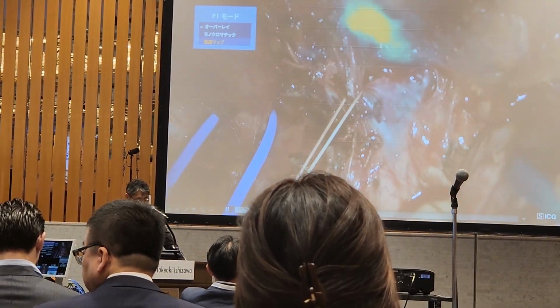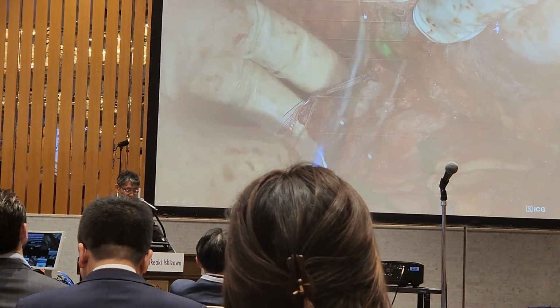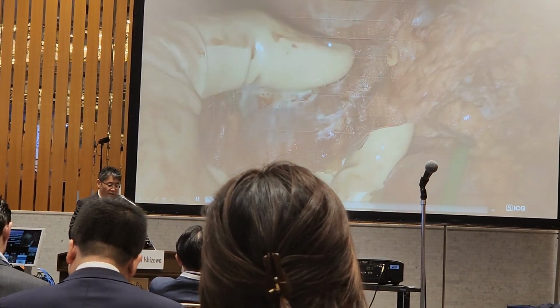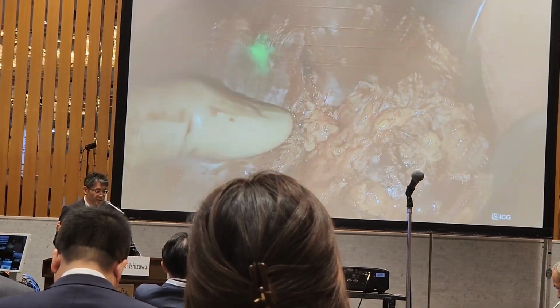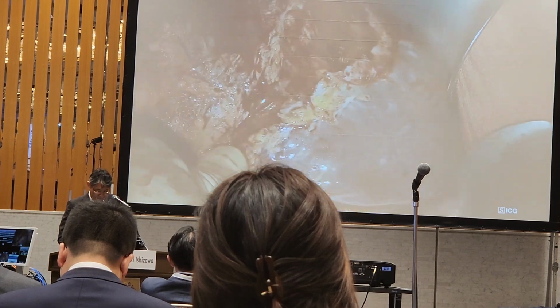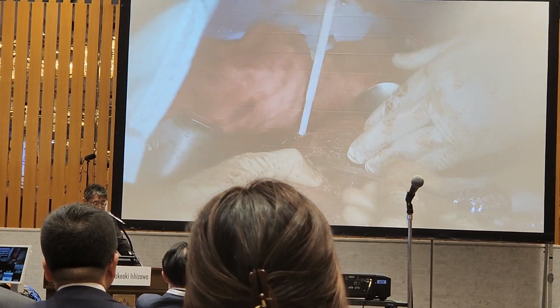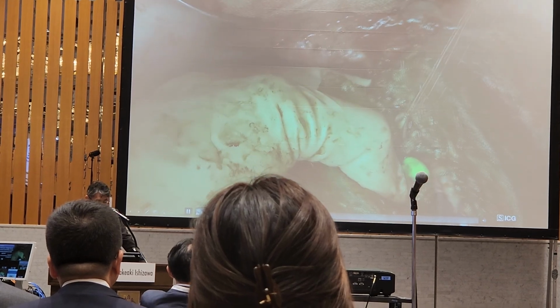This is the tumor fluorescence signals, very strong. And the right hepatic duct is divided. This is the tumor. And there are other fluorescence signals emitted from the remaining 2 tumors. And no fluorescence signals from the left liver are observed. Then the hepatic parenchyma is transected to identify the middle hepatic vein to be dissected. And the middle hepatic vein is ligated. This is the tumor.